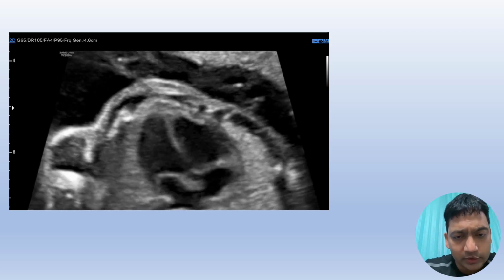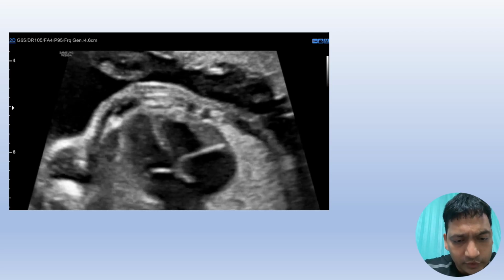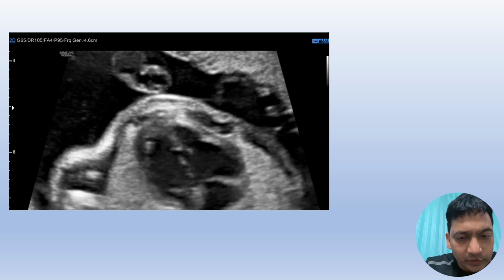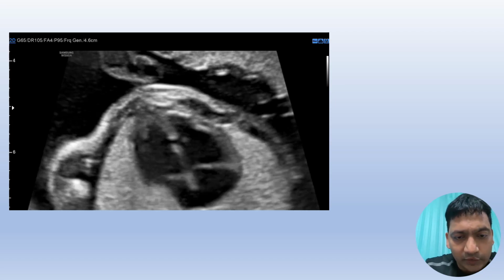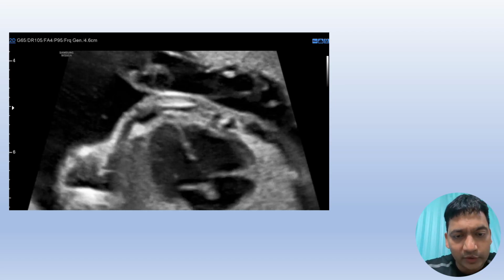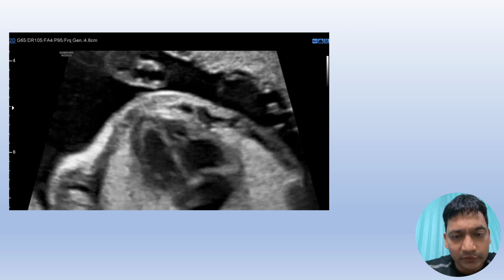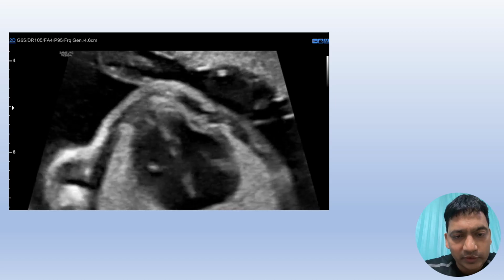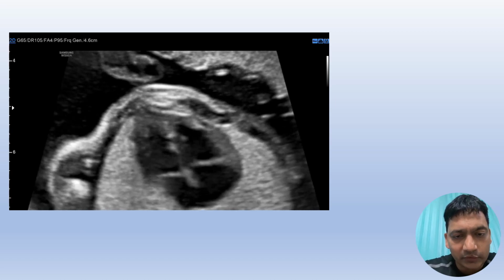What I mean to say is, if I pause this video and then play this video frame by frame, then whenever you see the VSD, this is the VSD, you can see the VSD over here.